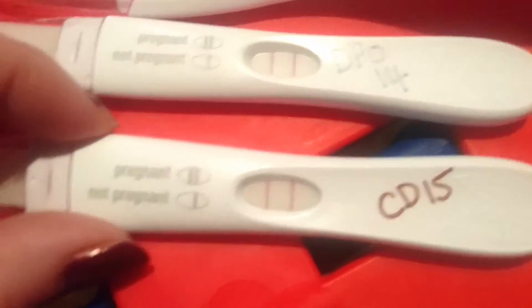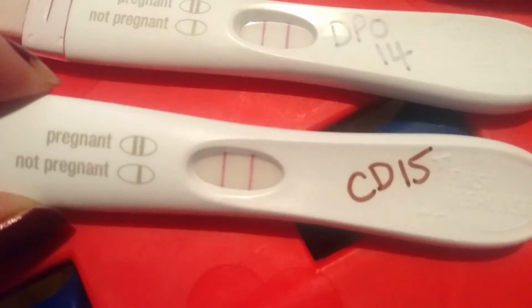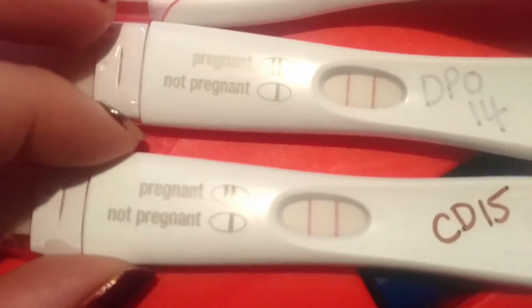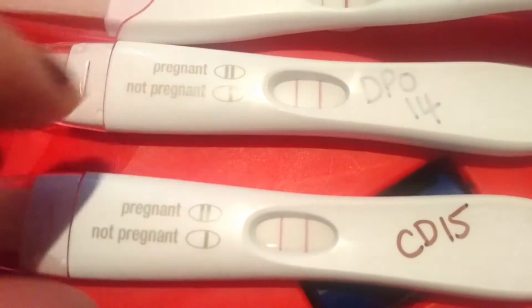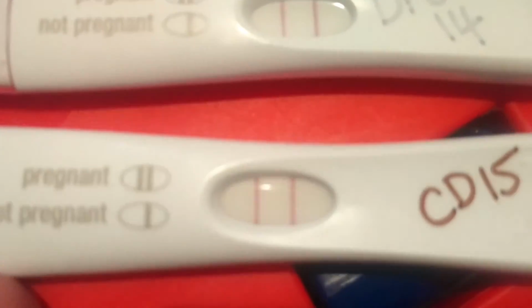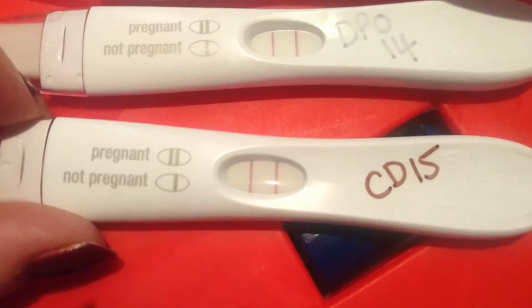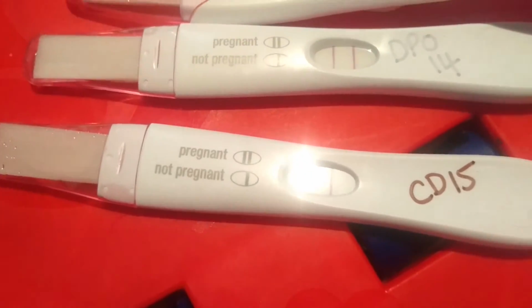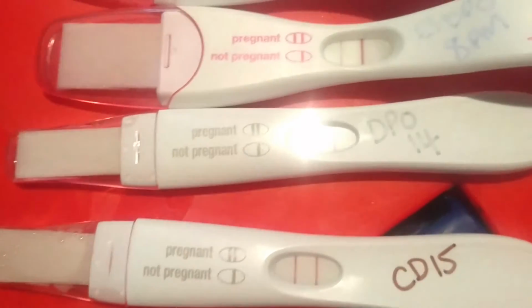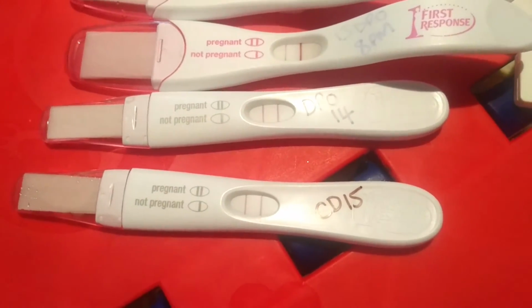And then this morning, I've literally just done this one, and you can see how strong they are. I don't even have to say anything. They speak for themselves. And of course, this one's dried out, so this one's a bit darker. And this one's just done, so this will actually get darker as it dries out. So there's no question about it. The pregnancy is progressing really well. Obviously, I will still get a little bit nervous. What mummy doesn't? So I will probably still be checking it every now and then.